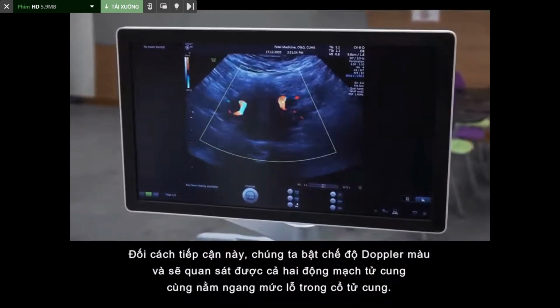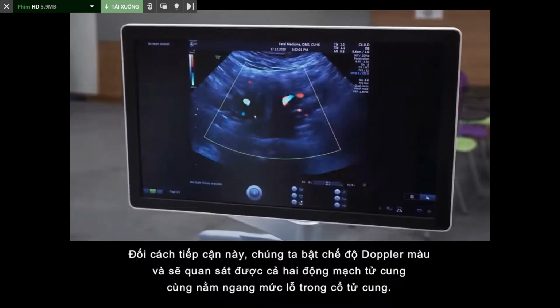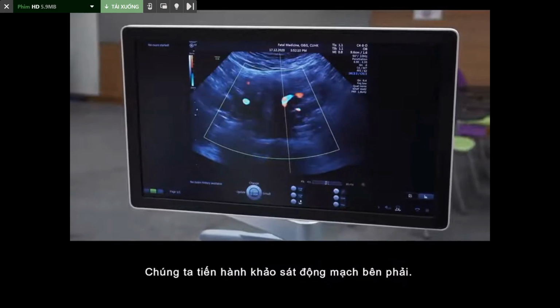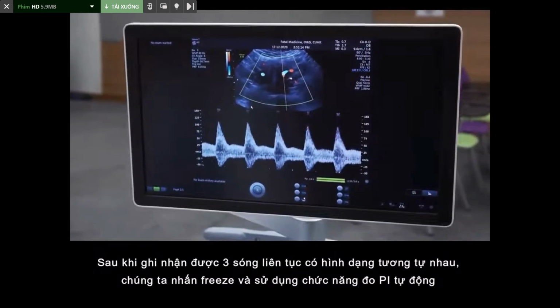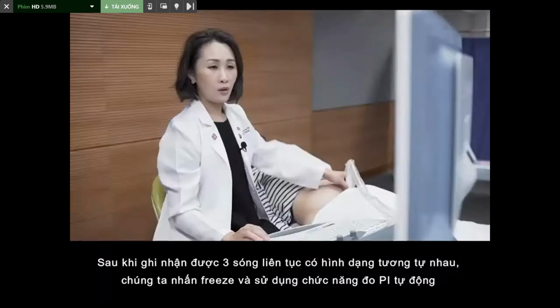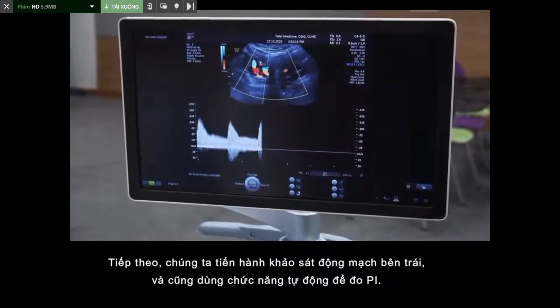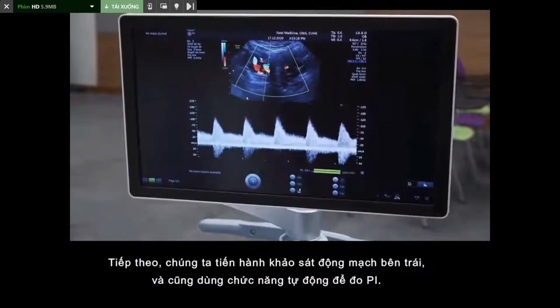So through the transverse approach, now you turn on color flow mapping. You'll be able to visualize both uterine arteries at the level of the internal os. So this is the right artery and this is the left artery. Now we measure the right uterine artery. And once you see 3 consecutive waveforms that are similar, we freeze the image and you use automatic function to measure the pulsatility index. So now we measure the left uterine artery pulsatility index. We use automatic function to measure the pulsatility index.